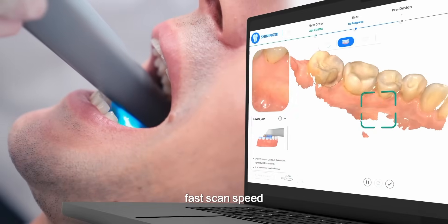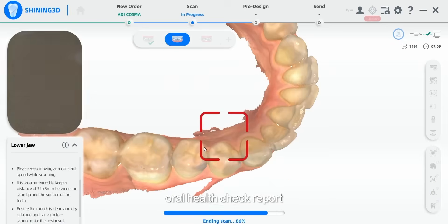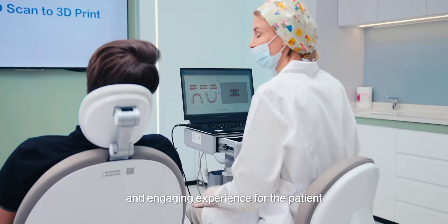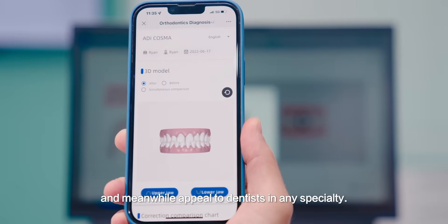High accuracy, fast scan speed, and a series of other features like motion sensing, oral health check report, motor grading, and ortho simulation accumulate into a modern, comfortable, and engaging experience for the patient, while also appealing to dentists in any specialty.